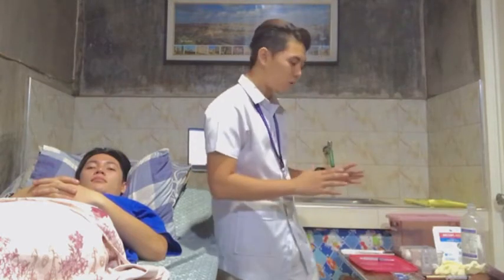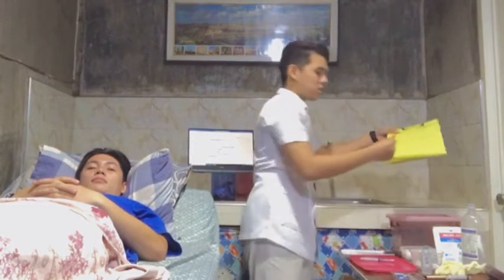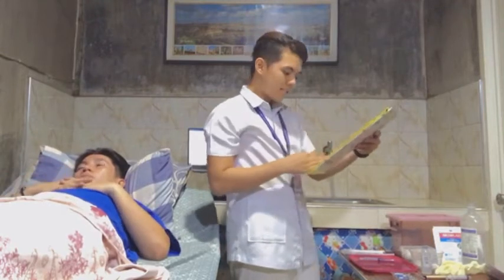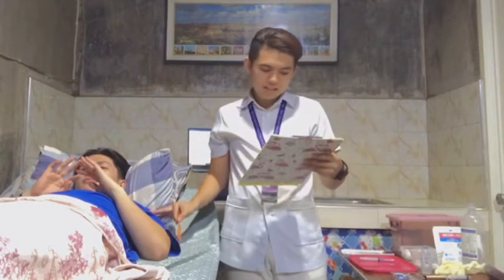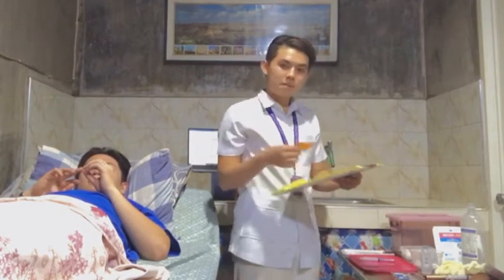So first, again, we'll be checking the doctor's order and the patient's chart because the chart of the patient is more reliable than the medication tickets. So I have here the medication ticket, and the doctor's order here says that the patient is experiencing dehydration, so we will be giving an intramuscular injection for our patient today.